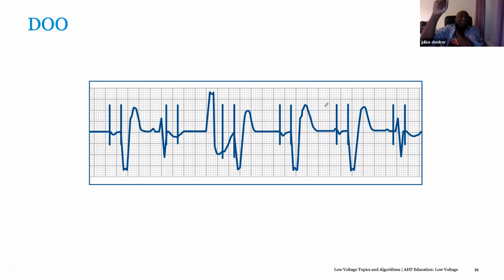Eventually they tend to program them to VVI pacing, usually when somebody's really old and single chamber pacing will be adequate for their cardiac output and circulation to get about. But yeah, Medtronic call it a single pass lead. I've sent one to Dr. Daffy, who's got one actually. You should have one. Sorry, AJ, go on.